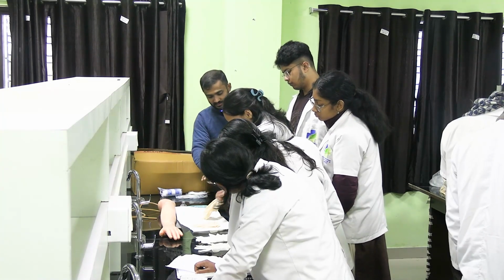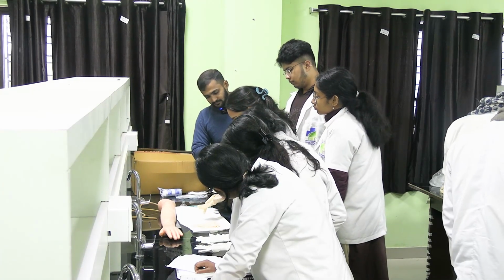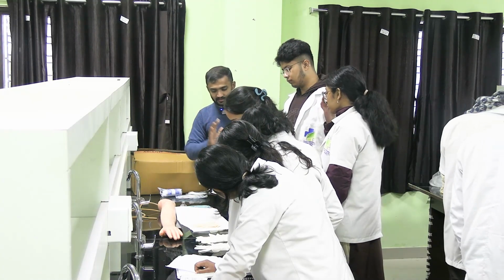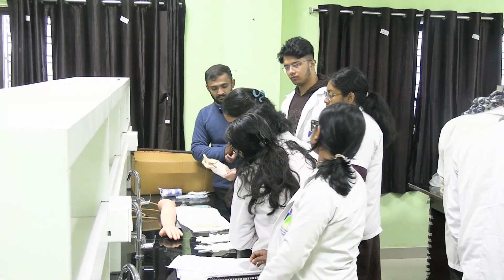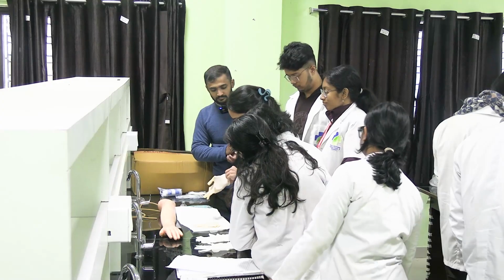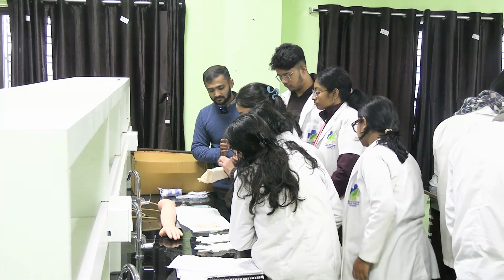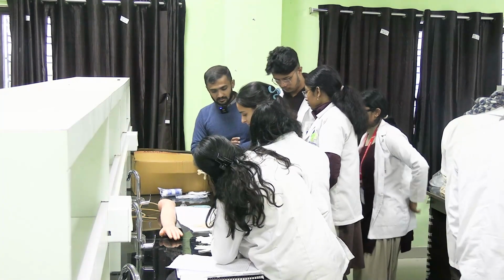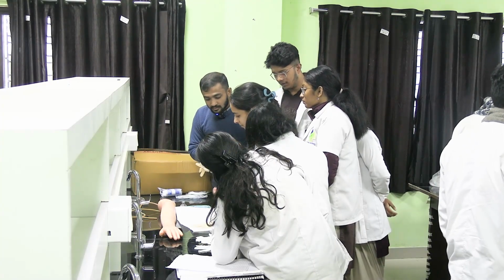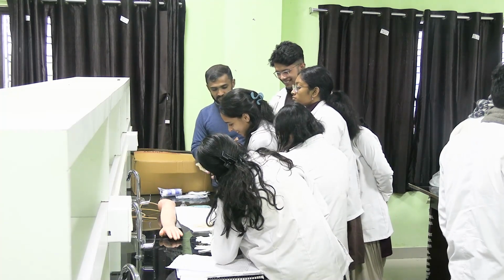Don't touch the outer part. First introduce your thumb, then serially introduce your other fingers: thumb, index, and so on.